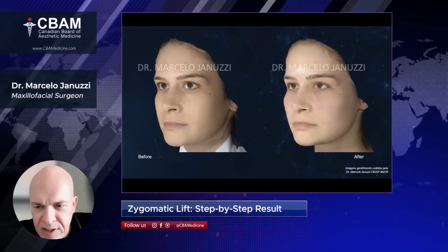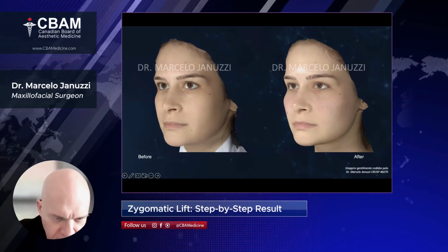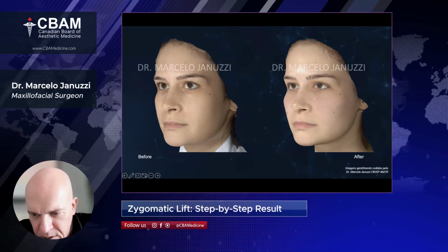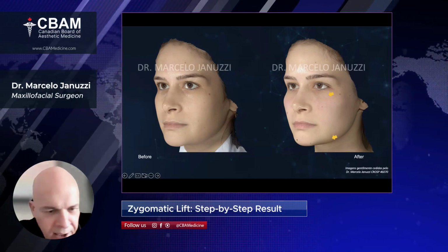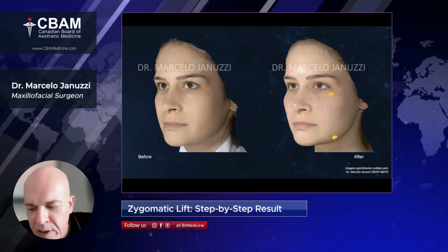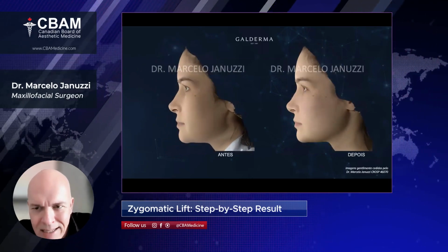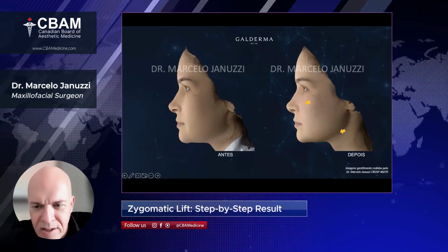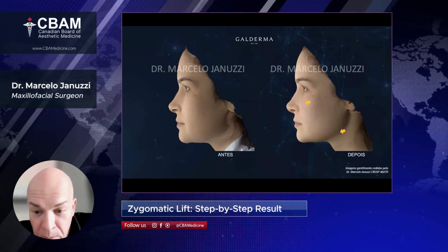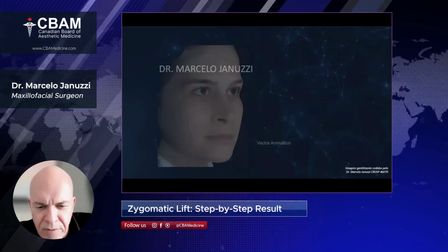The other side, the left side, the same. So we can see the same here. We have some wrinkle in the corner of the mouth, and here the corner is flat and shiny. So here we can see the difference in the tear trough and lateral aspect of the periorbital area and border of the mandible. The redesign 30 days later is incredible. The mandible is totally redesigned, and the volume of the cheeks is reobtained, and the patient is very happy.